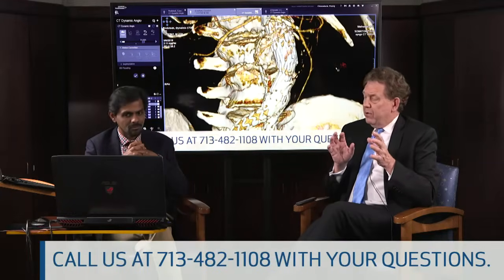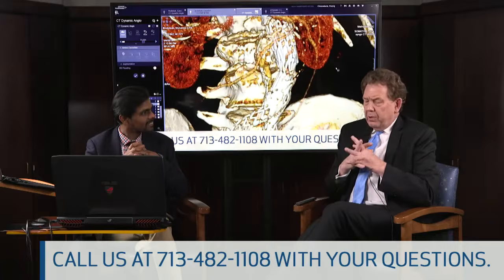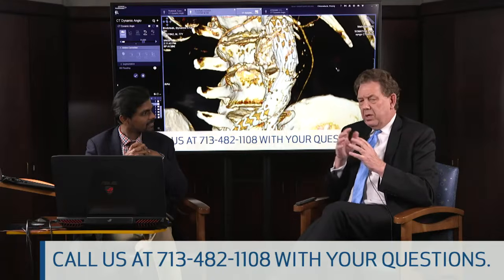Okay. I've never done transgraft. I know the president of the ICVS, Dr. Krazier, who's one of our friends from next door at Texas Heart, that's his preferred approach. And so I think one of the future webcasts we'll get Dr. Krazier to come over here and tell us how to do it. So I haven't really done that.